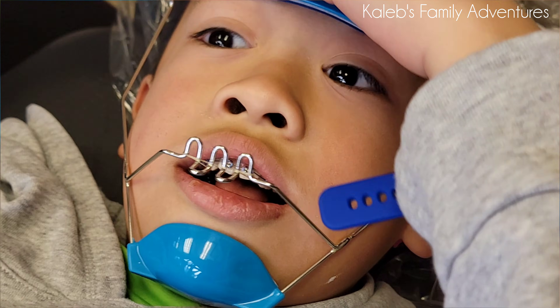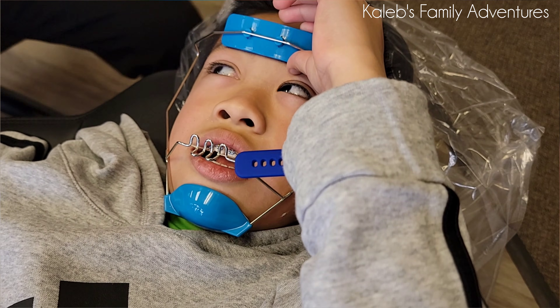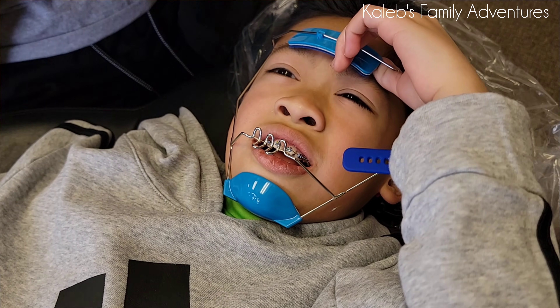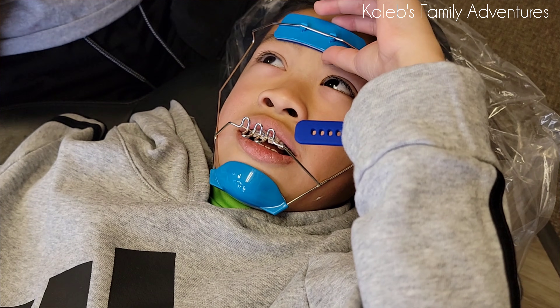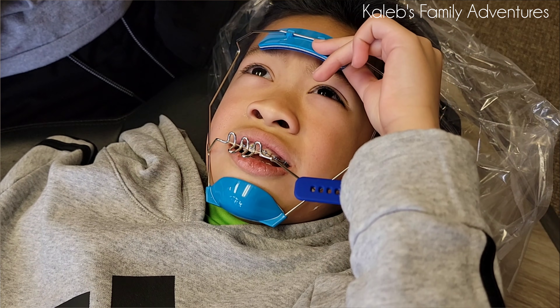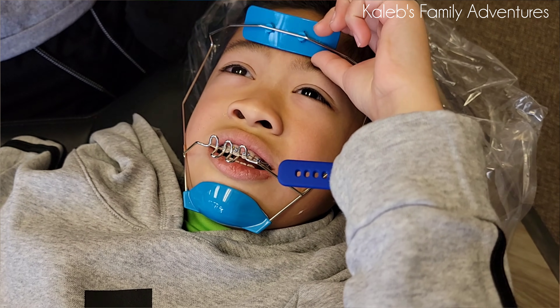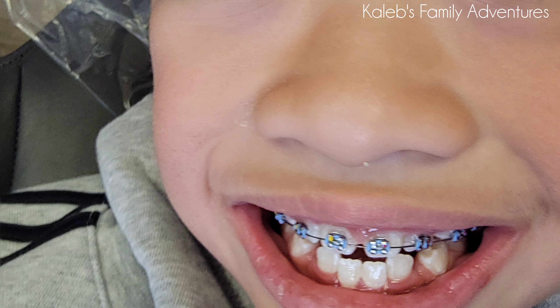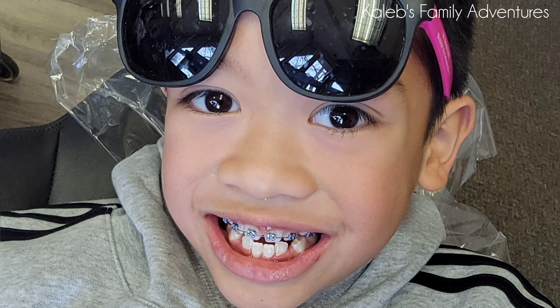Okay, got it. Every night — yes, this will be every night. I know for the first couple nights it'll probably be hard for him to get used to, so tonight maybe just try to get him to wear it for like an hour, you know, tomorrow two hours, three hours — and he'll get used to it. All right, you're good.